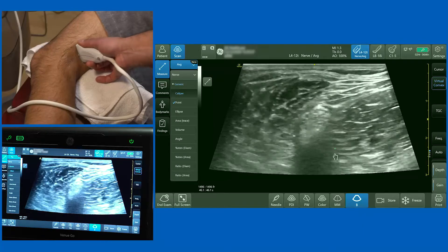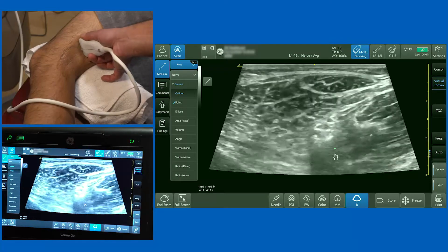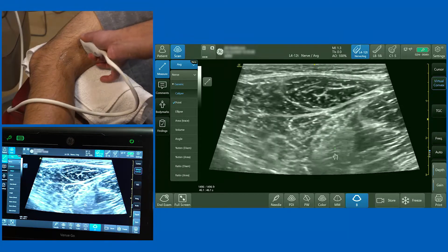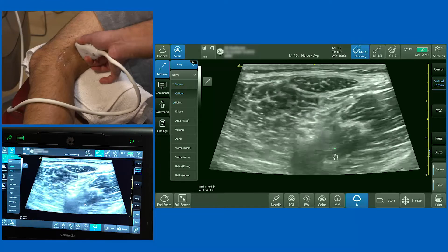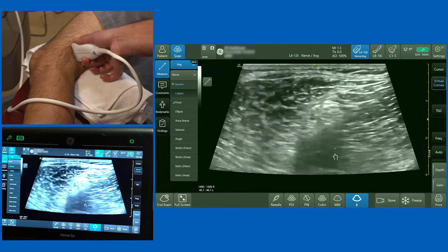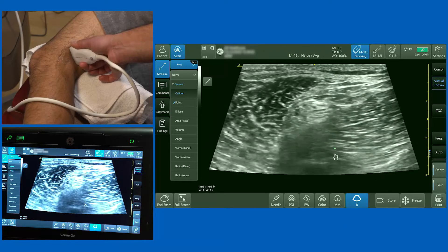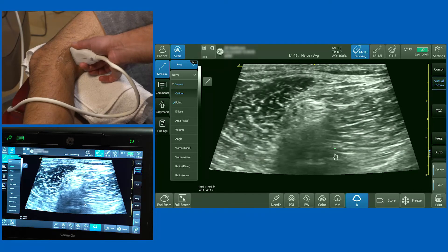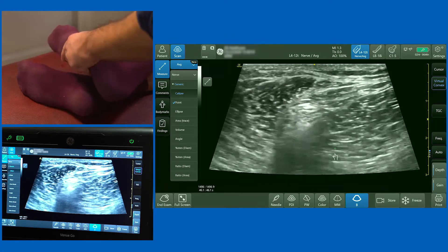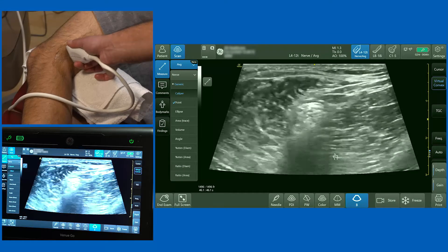With the right pressure and angulation you can follow the nerve relatively proximally up the thigh. As we slide distally it comes more towards the surface. Because it's an anisotropic nerve, changing the tilt of the probe is really important — plantar angulation makes it easier. There's a useful trick to help identify the nerve called the seesaw movement: move the leg up and down and you'll see the two components of the nerve move on each other. You can see the tibial nerve rotating as the leg moves.